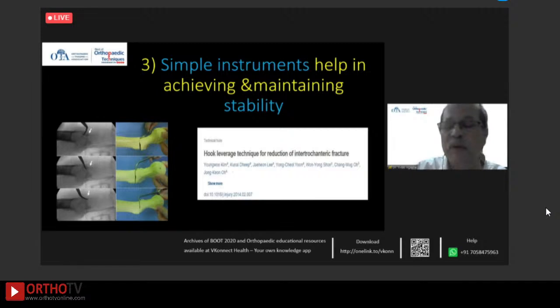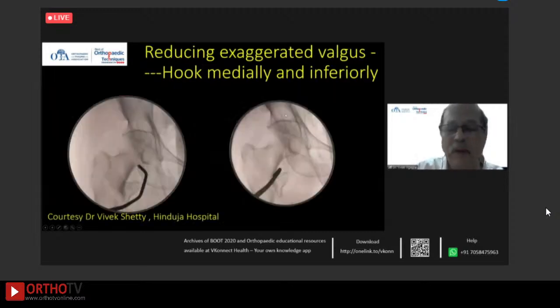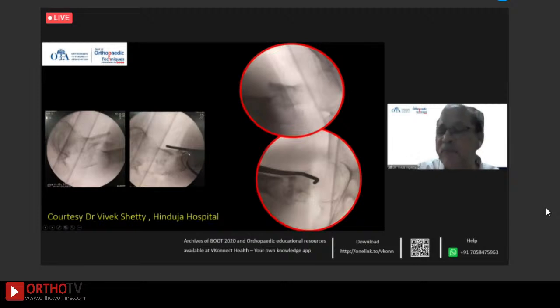Several methods are described, and we have many simple but useful tools and tricks. The spikes, the hooks, which have various angles, the Schanz screws or Steinmann pins, or even a hemostat. These crooked hooks can be put in percutaneously. If there is an excessive valgus, they can be put in on the medial and inferior side. If there is a significant varus, they can be put superiorly and laterally. If there is an anterior displacement, they can be put anteriorly.